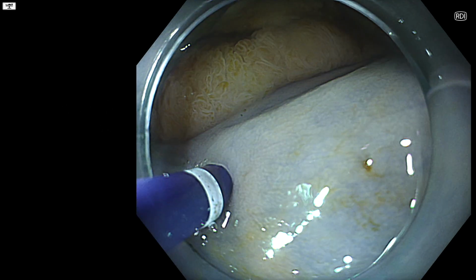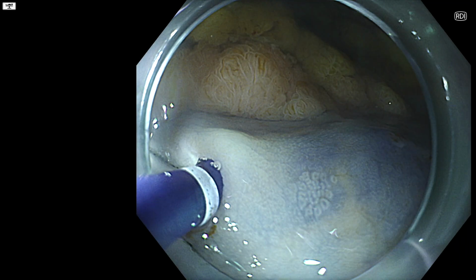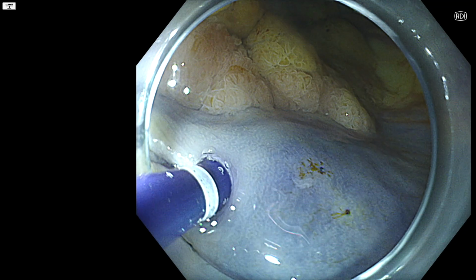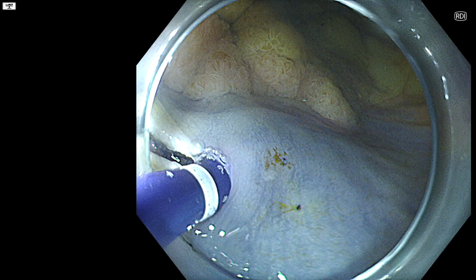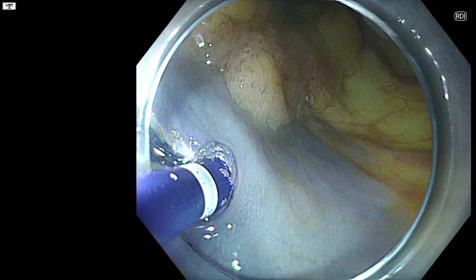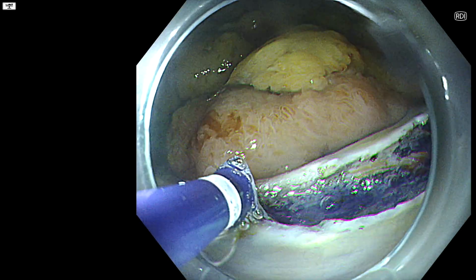And this way we can avoid puncturing them, which can be a bit of a pain at the beginning, as it creates a submucosal hematoma which obscures the field. And we can also see them during incision, so we can employ the coagulation current appropriately to reduce bleeding. So it's not strictly necessary, of course, but these small things I think do add up in the end.